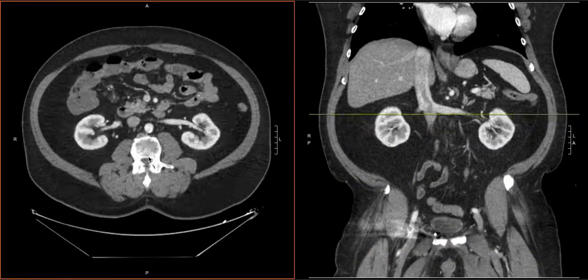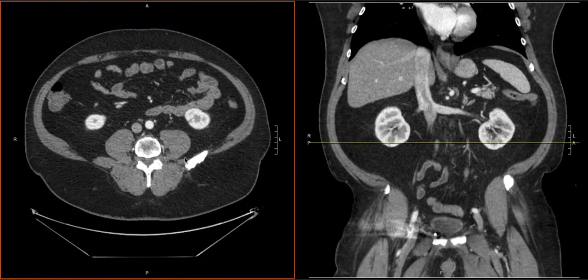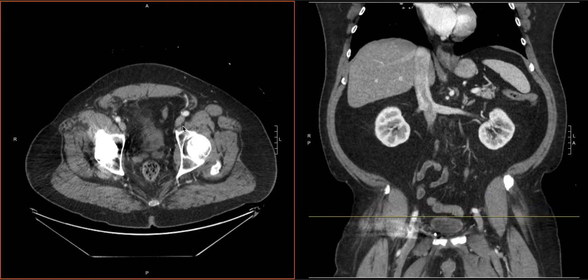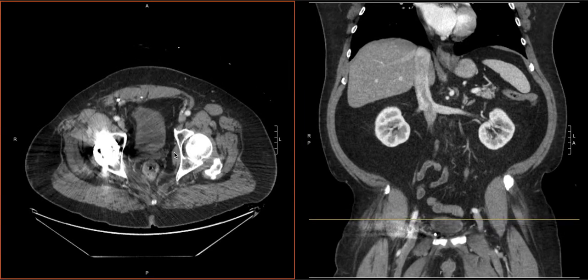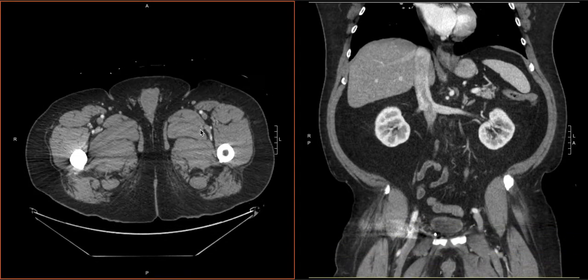Then we can go back to our left kidney, and we can do the same thing. So here's the ureter that's coming out, and there it is right there. It's a little hard to track it, but here we get a little better look at this one. It's right there, and there it is, right here. Again, this is something you have to get a feel for, but it's coming in to plug into the bladder right there. I think it's pretty helpful to run the ureters and make sure everything looks okay, and then it naturally brings you to the pelvic organs.